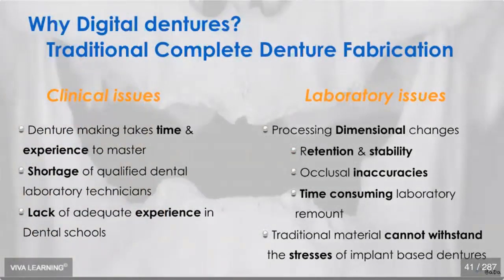So why digital dentures? The problem is, clinically, denture making takes time and experience to master. Now, we all know that it takes us many sets of dentures when we started the practice of dentistry to kind of master how to fabricate complete dentures. There is a shortage of qualified dental lab technicians, and there's also a lack of adequate experience in dental schools.